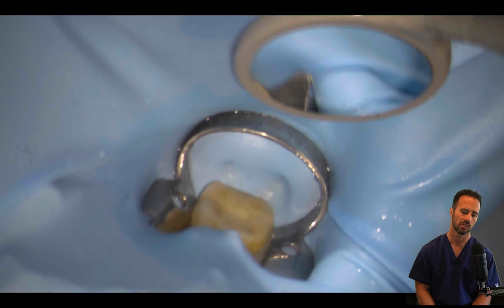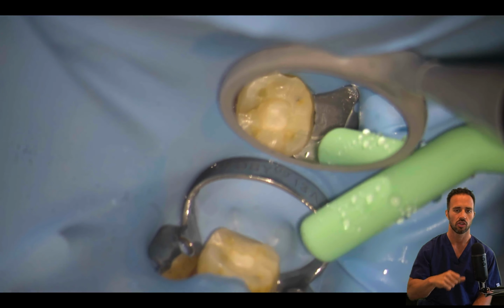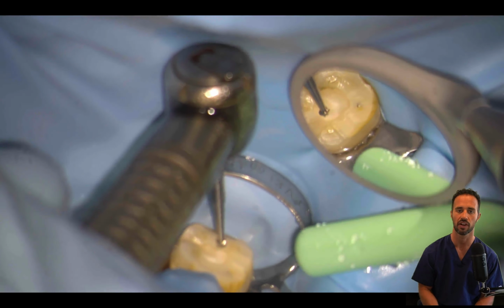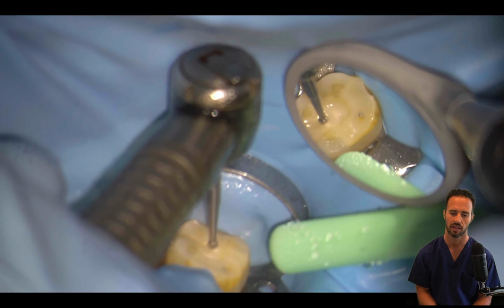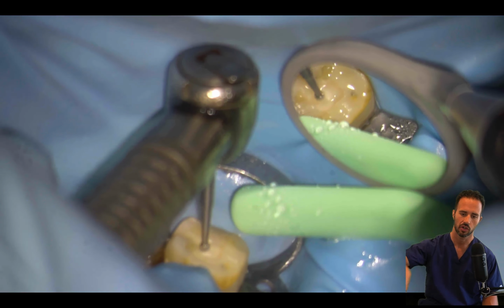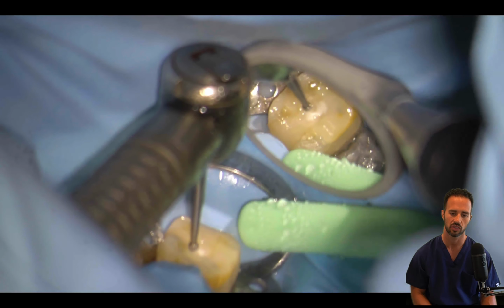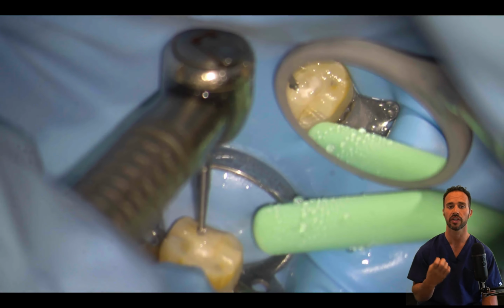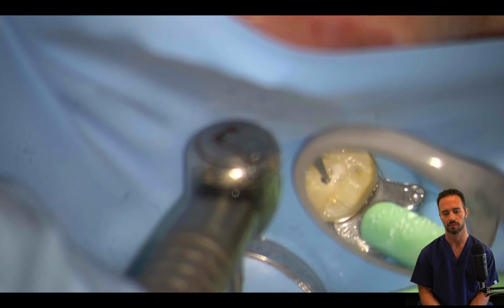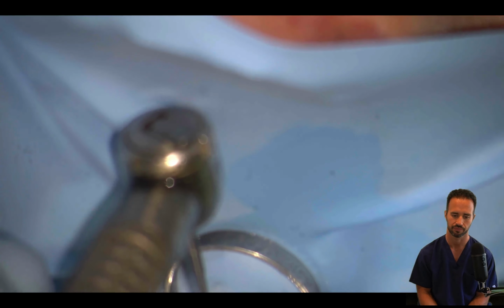So we're simply going ahead and removing that Fuji 9, and we're going to basically drop right into that sterile sponge. So don't worry about being too quick with this. You should just drop right into the sponge, which is going to stop you from progressing with your bur and doing damage from where you left off last time. So just going around circumferentially around the confines of where that Fuji 9 is inside the tooth, and we're going to eventually just drop right into where that green sterile sponge is. If you have another color sterile sponge, sometimes we use yellow as well, but in this case it's the green sponge.